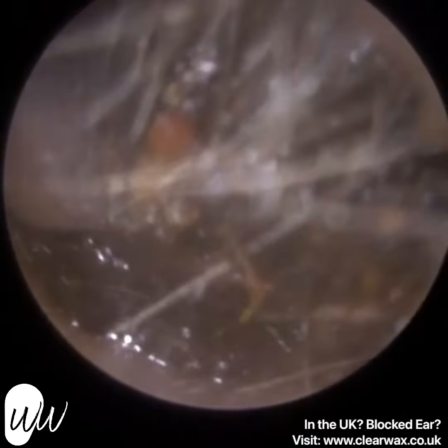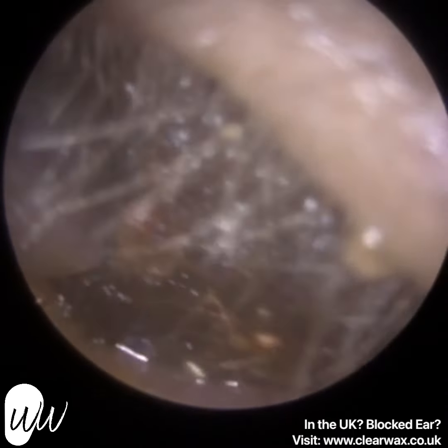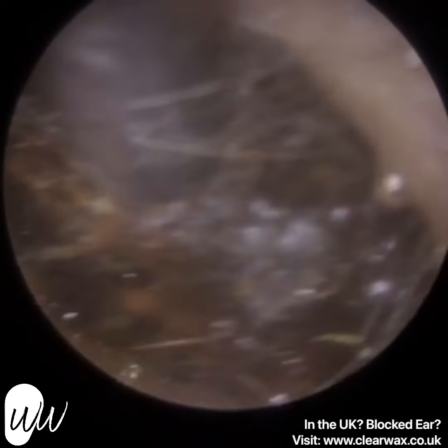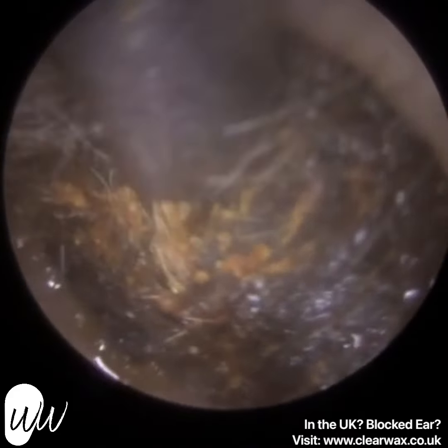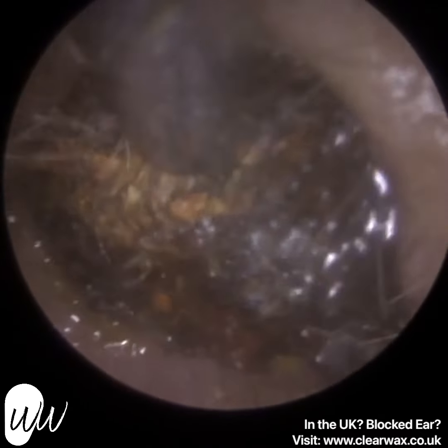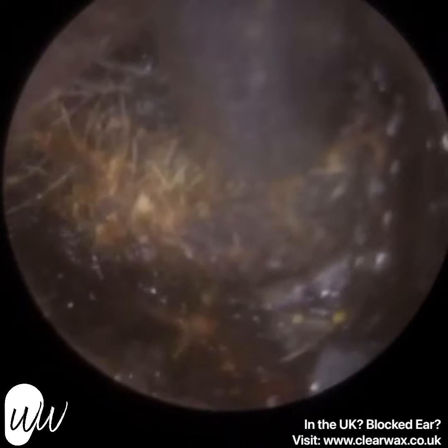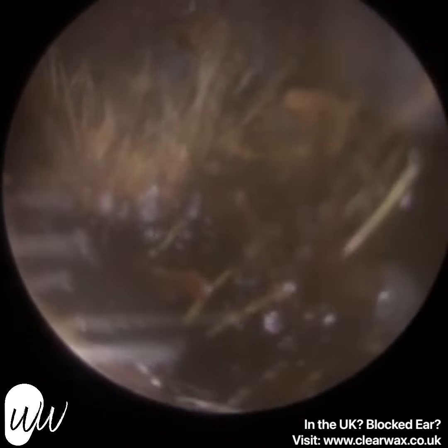But the main reason is that when I'm training delegates, I wouldn't train inexperienced delegates using the sharp metal instruments, for obvious reasons. And so I want to train them in the way I'm performing the wax removal. A lot of the delegates watch the videos, and as you can see, it's seldom that you need to use those sharp instruments. I do recommend that once they're more experienced, in certain instances where it's absolutely necessary, they use the sharper one, because the Cawthorn hook tip is very, very sharp.